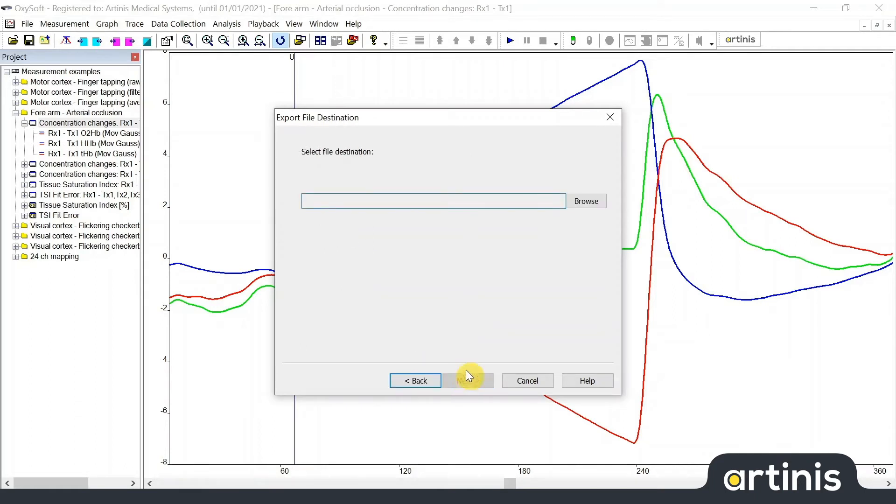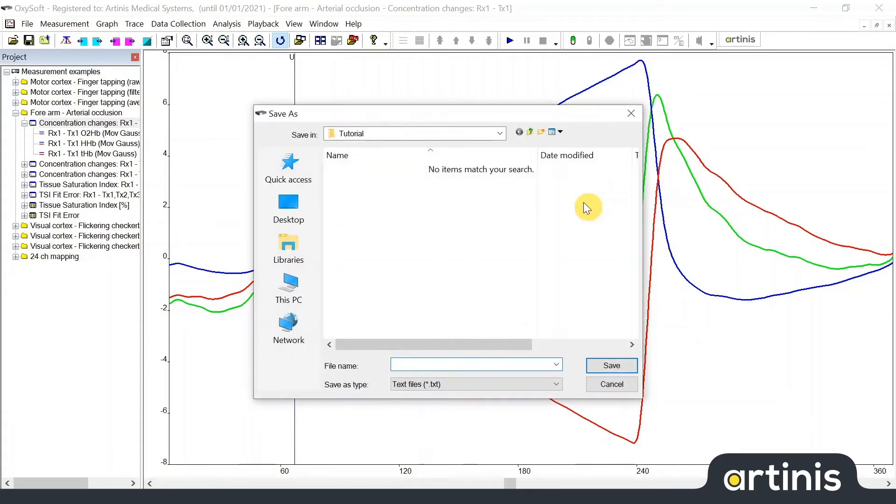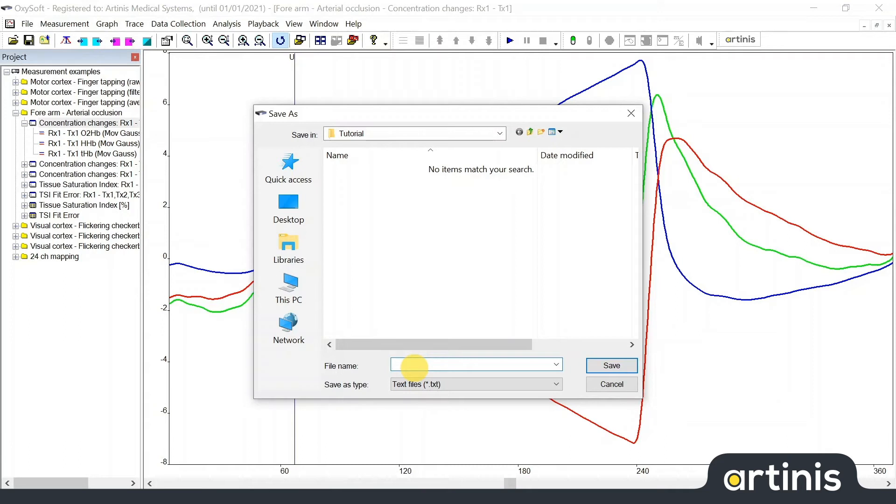In the next window we can select the file name and destination. Click browse to specify the file location. For this tutorial I will save the data on my tutorial folder. Data organization is very important and therefore we recommend to save your files in a structured and organized way. For example date, subject, project. Click save.